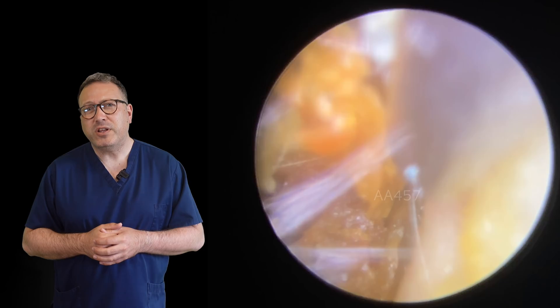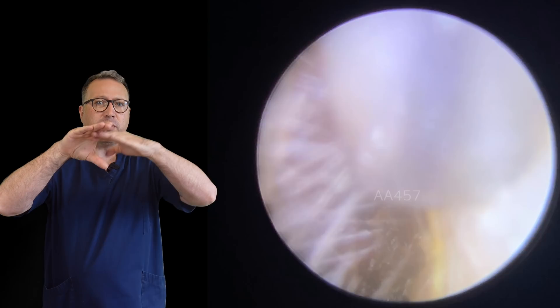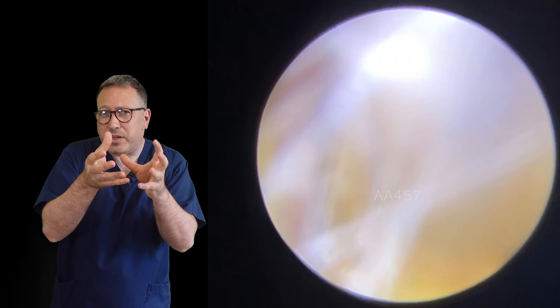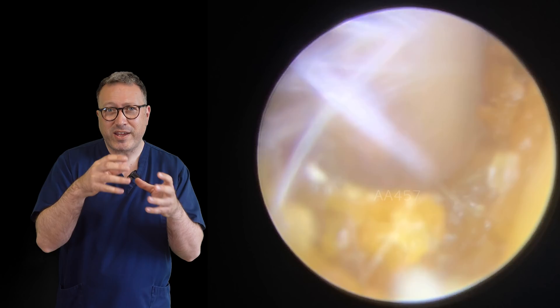We're going to use the crocodile forceps here. We tend to find with skin that if you put suction onto it, what happens — if you imagine this is the end of the suction tube — as the skin goes in, it vibrates up and down really quickly and causes this really high-pitched shrill whistle. So what I personally always try and do is move the skin into a more manageable position and then go in with the crocodile forceps so we can get a good solid grip on that to take it away. So what we've got now is the standard size tube back in, just tidying up these little tiny flakes, breaking these little bits of wax and skin down.